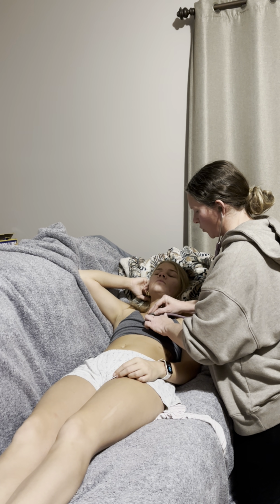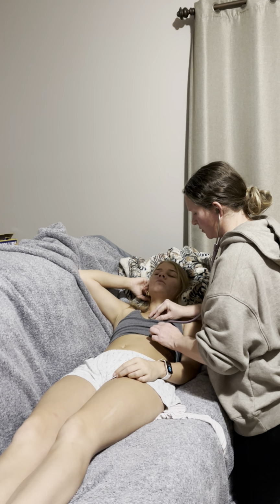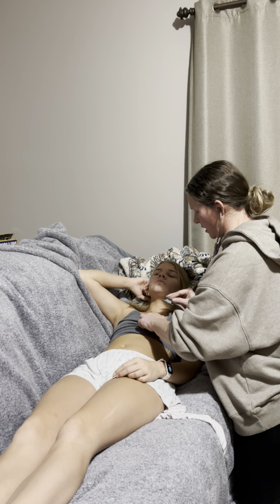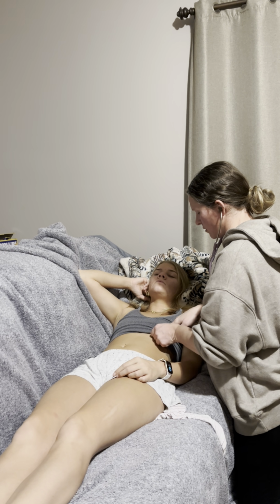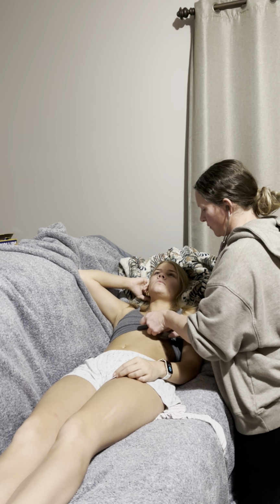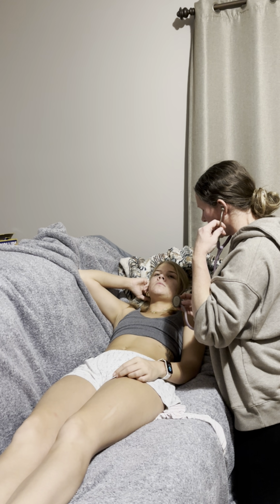I'm going to go down one more to tricuspid. And one down. I'm going to follow it along. Perfect. So rate and rhythm are normal.